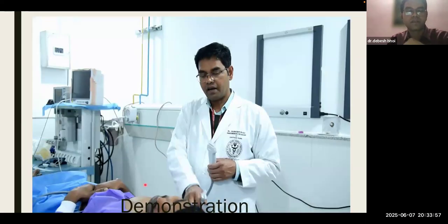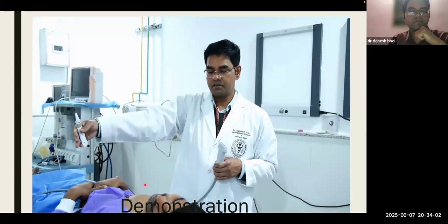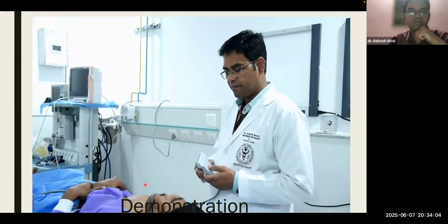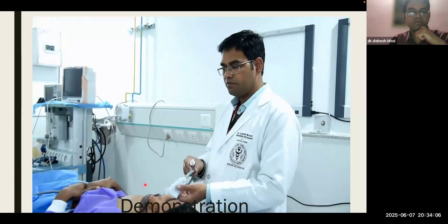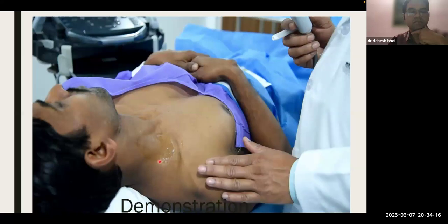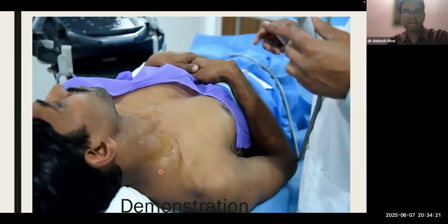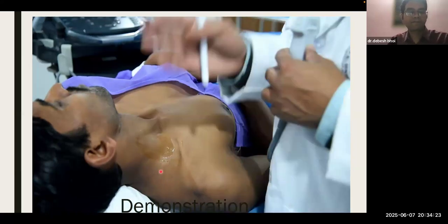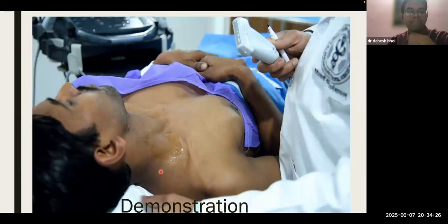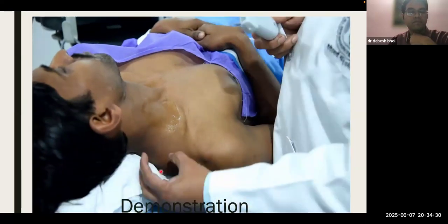I will be standing here at this part, and the machine will be kept there. The probe is going to be placed like this. Your patient will be placed supine, if possible little head up, so that it is comfortable for him. Then you'll be standing at the station where you are going to do the block. Put a small bolster over here and keep a little bit of free area at this area.